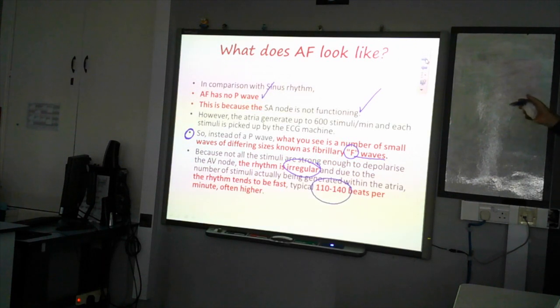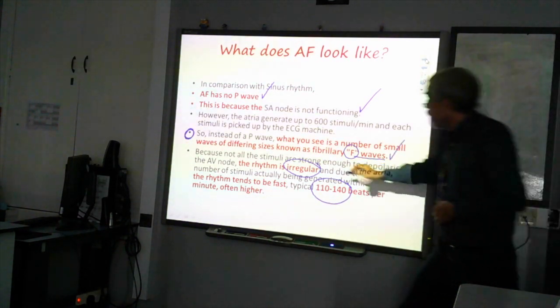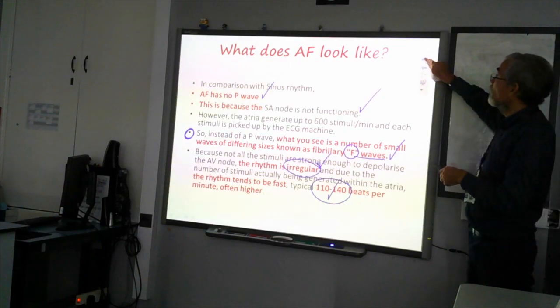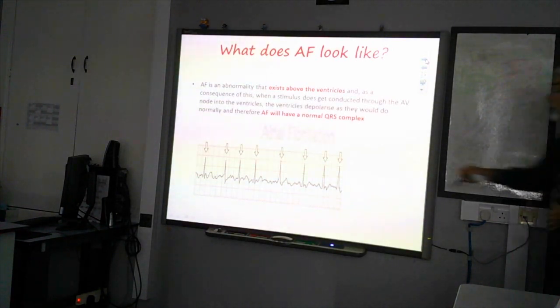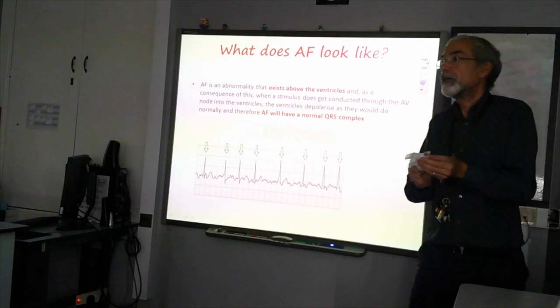So, important things to take away. P wave? No. No P wave. Instead, you have F waves, which are very irregular. What do they look like? Like spikes. So these, in fact, we can come up again.